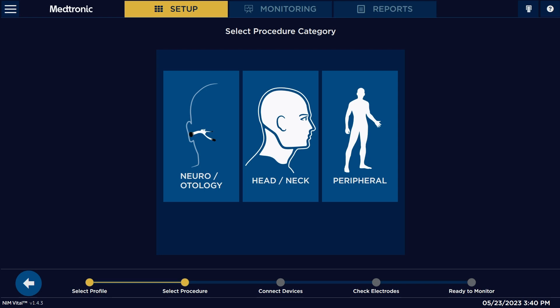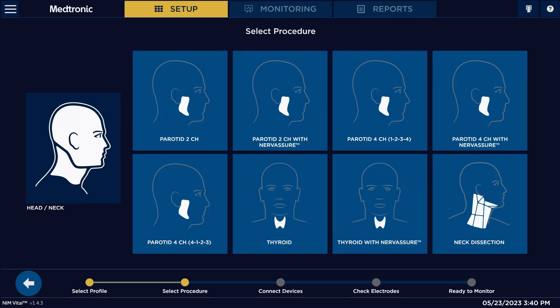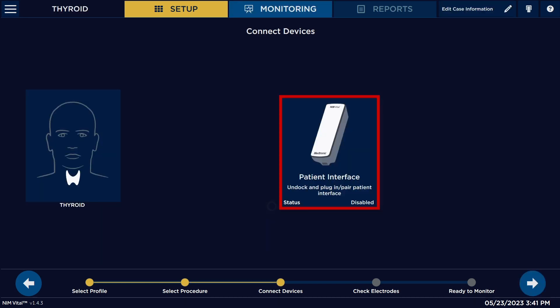So let's say we're wanting to do a thyroid case. We're going to hit head and neck, and then here are all the different sub-procedures that go under head and neck — for example, parotid, neck dissection, or thyroid. So let's pick thyroid. We pick thyroid and now it's asking us to undock our patient interface.